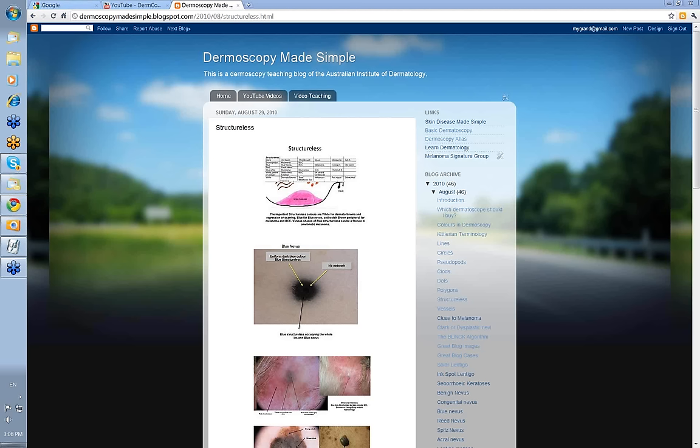Structureless is one of the five elements in Harold Kittler's diagnostic algorithm. If you look at it and go stepwise through his diagnostic algorithm, remember lines come first.